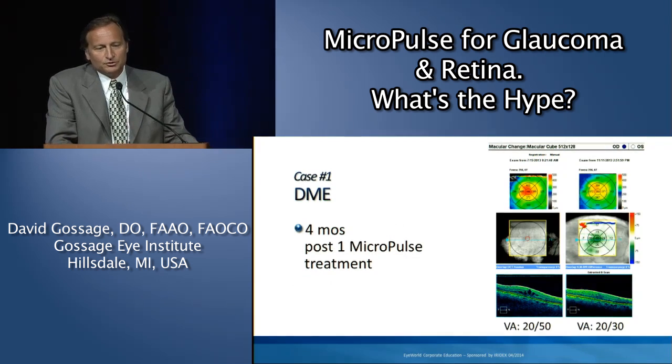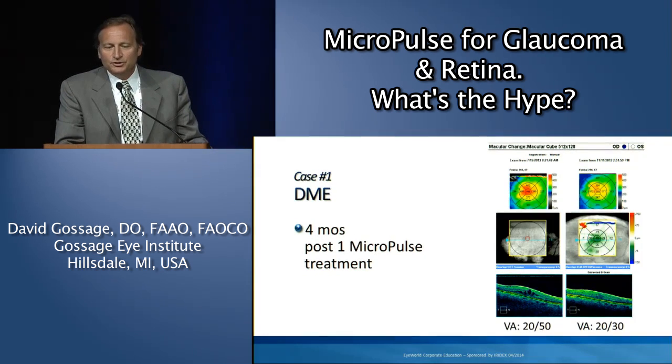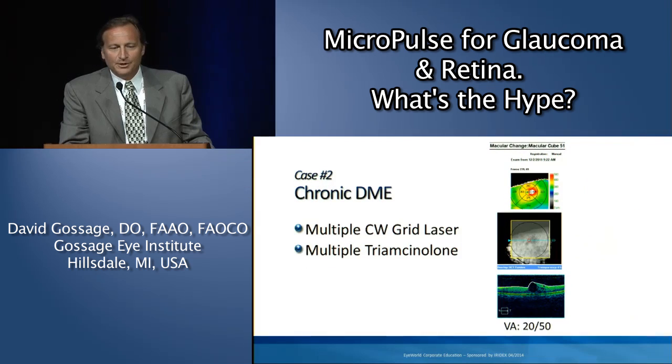So we did a MicroPulse treatment on this patient, and this is 4 months post-treatment. Some resolution of the edema with visual acuity improving from 20/50 to 20/30, and this is with just MicroPulse applied.